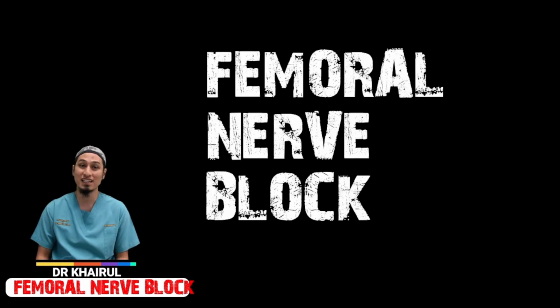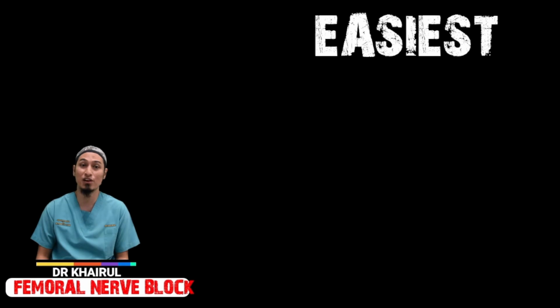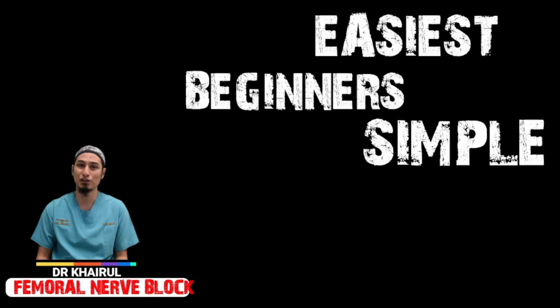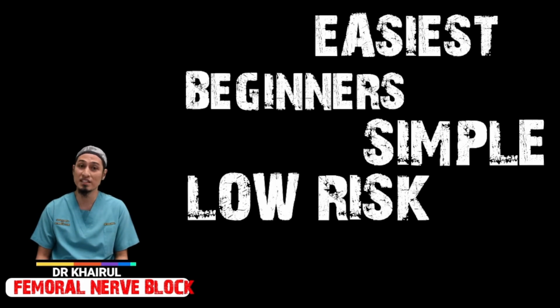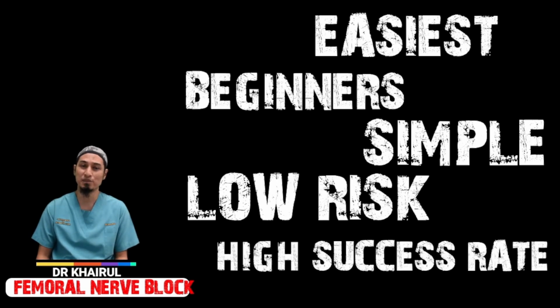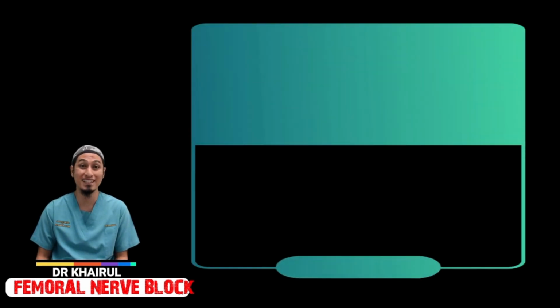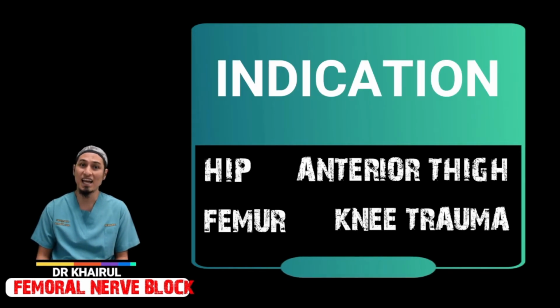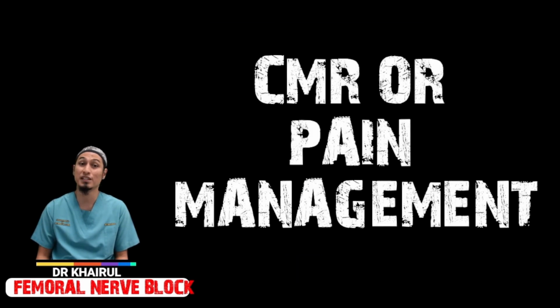Assalamualaikum and hi everyone. In this video, we are going to show you how to perform a femoral nerve block. It is the easiest and most superficial block, which can be performed by beginners. It is relatively simple to perform, carries a low risk of complications, and results in a high success rate. The indications for femoral nerve blocks in EDs are usually for hip, femur, anterior thigh, and knee traumas, either for CMRs or pain management. So now, let's see the technique for femoral nerve block.